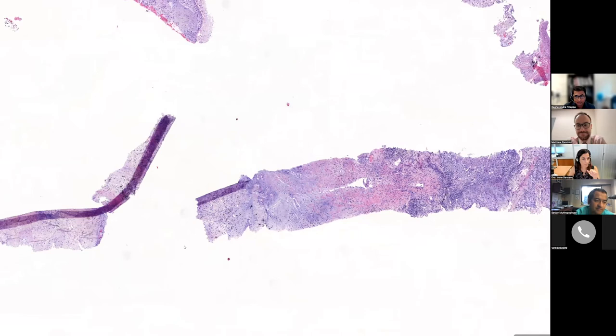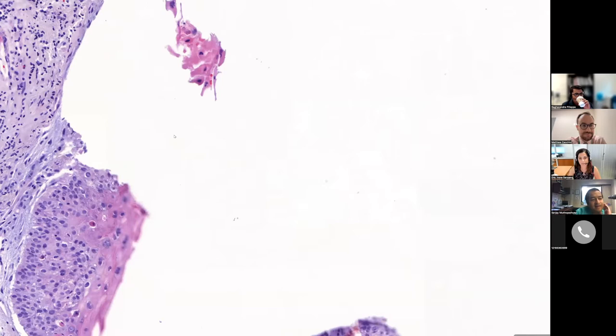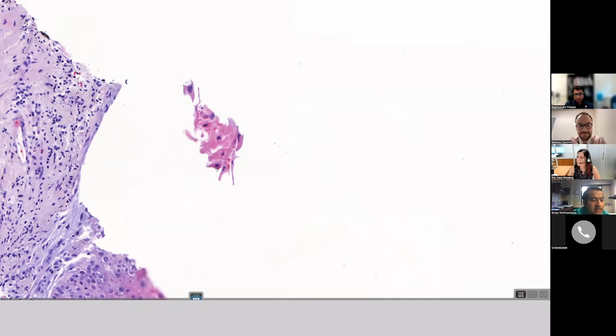Okay. Actually, I had some keratin here, but this cut got folded, but here we can see keratinized epithelia. We can move to that. Yeah, and one more thing I'll add, Irene, if you could just bring it to any one of the tumor nests, just bring it to the center of the field.